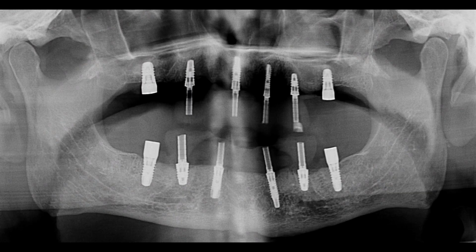This panoramic x-ray shows the additional 4 implants that were placed 6 months after the bone grafts and 6 months after the initial surgery. We added these 4 back implants because I do not like to have cantilevers. The all-on-4 technique that you see on television, they leave their last implant in this position here, or here, or here, or here. And that means there's at least one tooth extended off the back side of the last implant. I don't like that. I don't like to have cantilevers when I can avoid it.